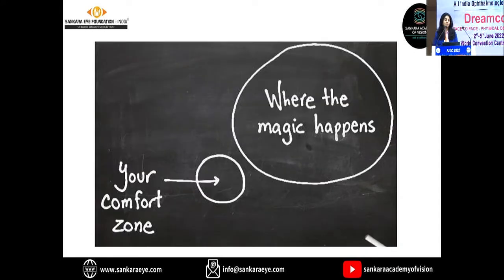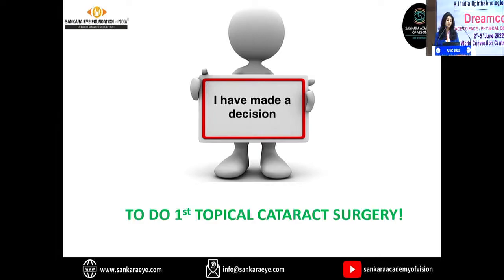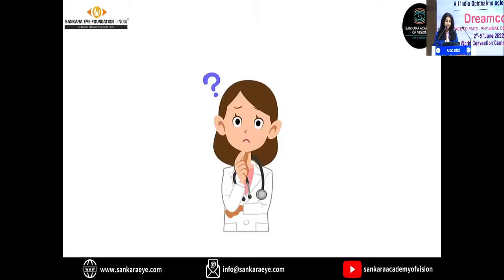So I had to somehow step out of my comfort zone, and that's where the magic happens. So I gathered guts and made a decision to do my first topical cataract surgery. But before taking this decision, I first asked myself whether I was comfortable doing an uneventful cataract surgery under local anesthesia. When that answer came as yes, only then I decided to take this leap of faith.